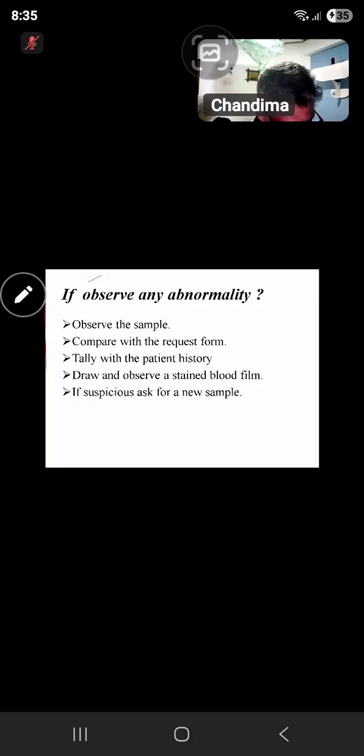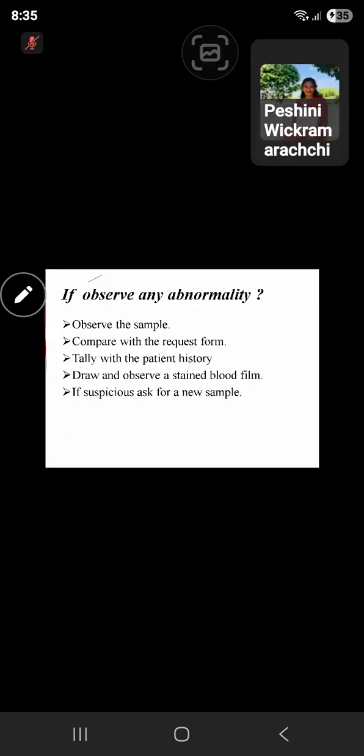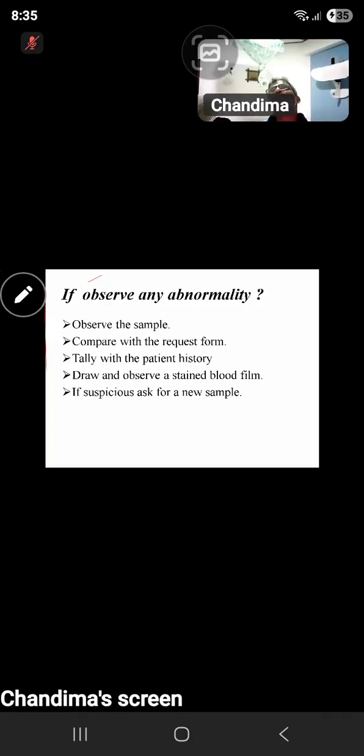When there is a low platelet count, sometimes the blood smear contains giant platelets. At that point, the PLCR value gets high. I am asking, is there any relation between the PLCR and the low platelet value? Is it related to giant platelets? Low platelet count and the PLCR value, right?